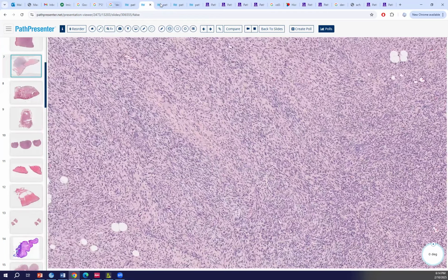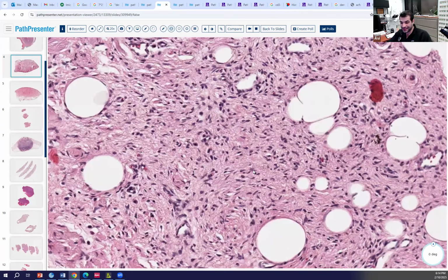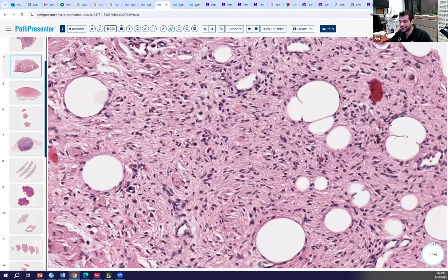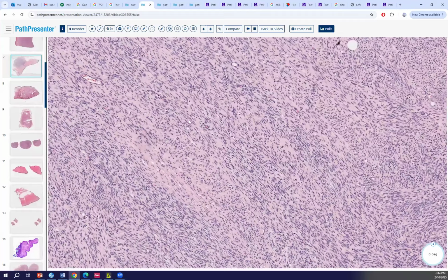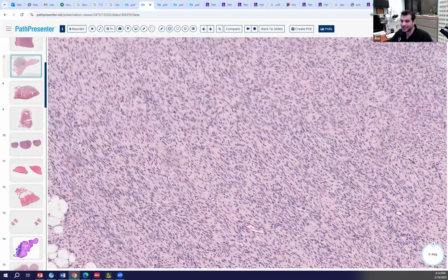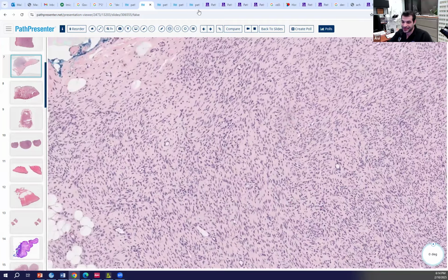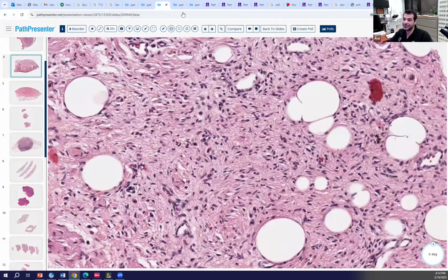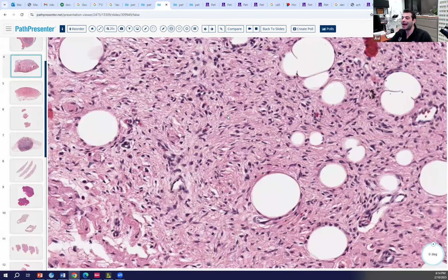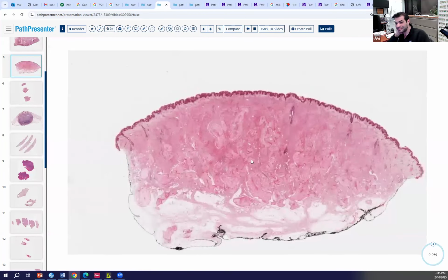Do you see that these spindle cells are very loose, as Shane mentioned? They're also random and haphazardly arranged. But these are not randomly arranged. These are very, very organized. The nuclei are in a row. Whether they're storiform or whether they're fibrosarcomatous, there's an organization to this. Dense, cellular, organized versus loose, not as cellular, haphazard.